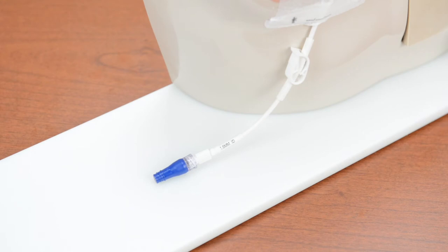You need to change the needleless connector no more often than every four days, or any time the connector is damaged or dirty. Follow your organization's policy for how often to change the connector.